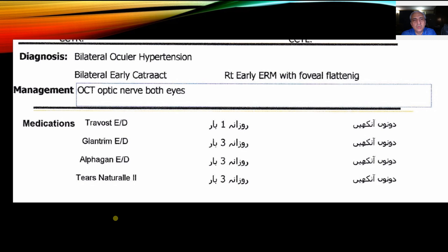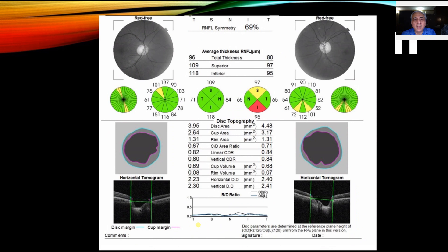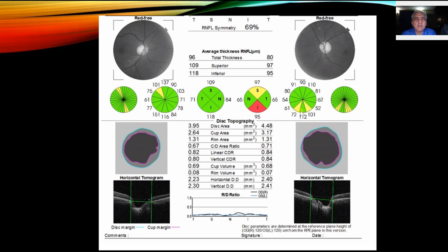The other important thing to look for on OCT is progressive thinning of the retinal nerve fiber. Here on the TSNIT map you can see it is now touching the red zone in both eyes. On the detail map, the average retinal nerve fiber thickness has dropped to 96 on the right and 80 on the left. The quadrant map, especially for the left eye, now shows a red area indicating significant reduction in the nerve fiber layer. In the clock-hour map you can also see damage in the borderline yellow zone. The vertical cup-to-disc ratio has slightly increased to 0.80–0.84.